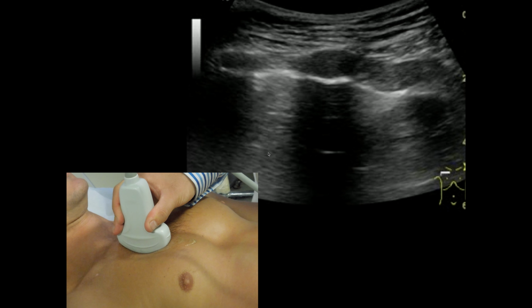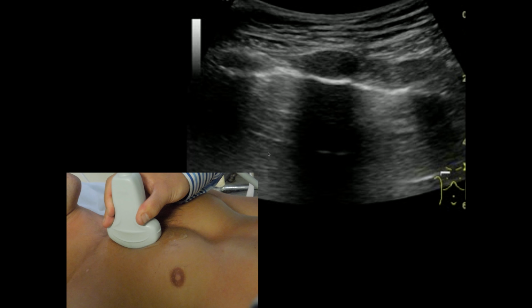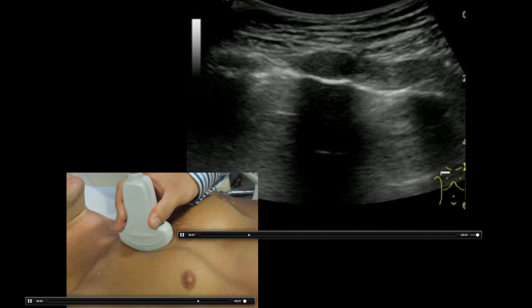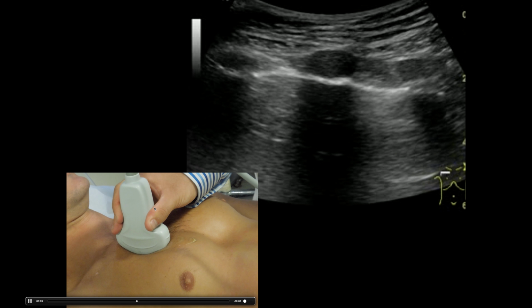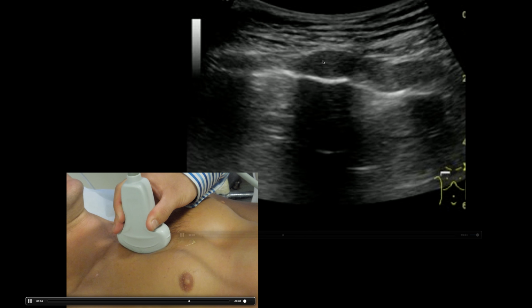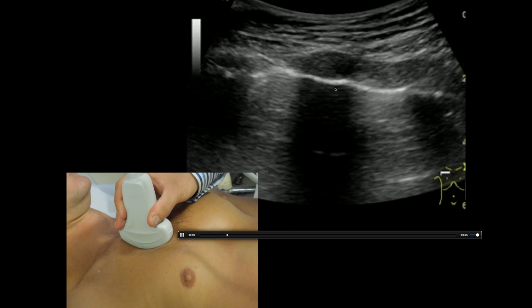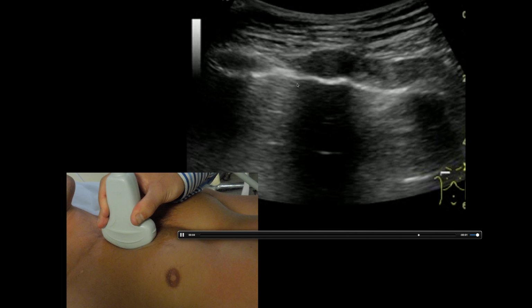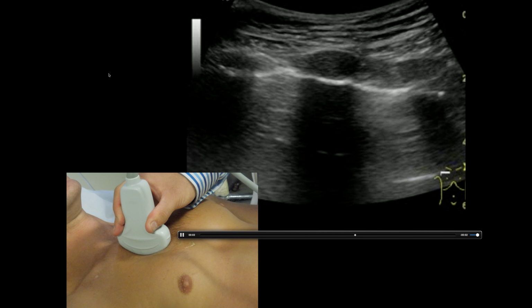Lastly here quickly, we talked earlier about where you want to place your probe when looking at lung sliding. Notice here it's just right side of the sternum, and this is the image you're going to generate. You make your depth smaller with your nice trans-abdominal or curvilinear probe. Here's your pleural line. Notice that bright white pleural line. Here are your ribs on each side, and your lungs are sliding back and forth, back and forth.